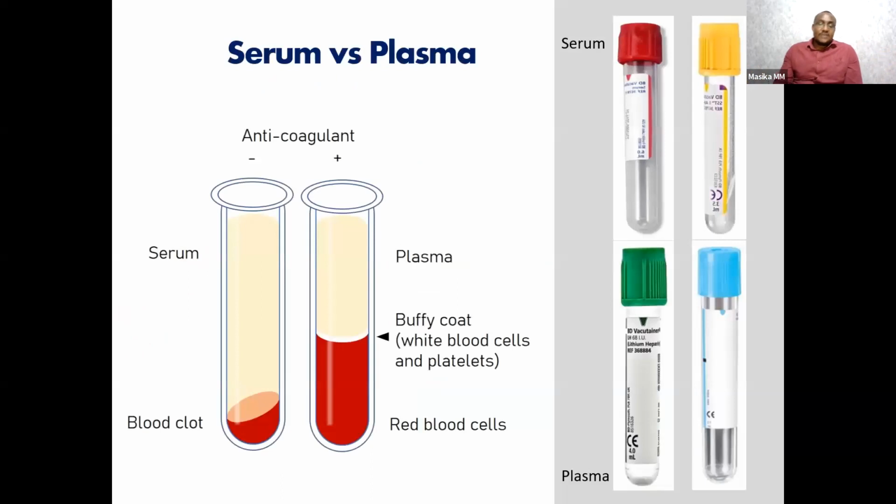So, once you understand these steps, then you know where things can go wrong. The first thing is your sample, and most of the time you're looking for antibodies in blood, but it's not actually whole blood. You can look for antibodies in whole blood, but there'll be a lot of noise and background because of proteins and non-specific binding. You can use serum or plasma.